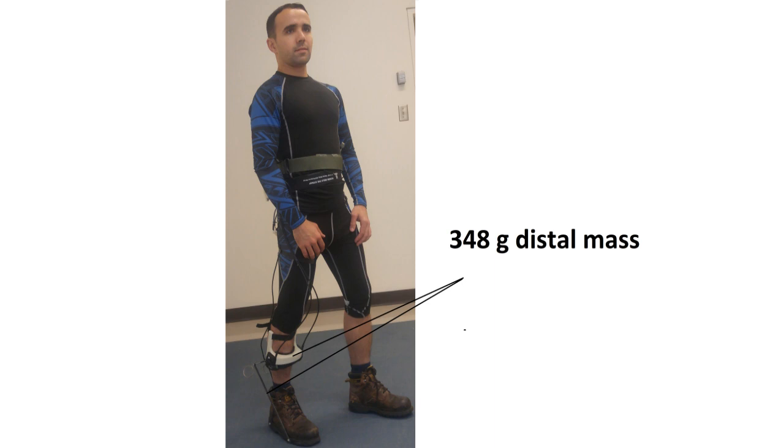Our exoskeleton has a total mass of 2kg and a distal mass of only 348g. This distal mass is 67% lower than the current minimum distal mass added by powered ankle exoskeletons. Our exoskeleton is also able to provide up to 50Nm of plantar flexion assistive torque.